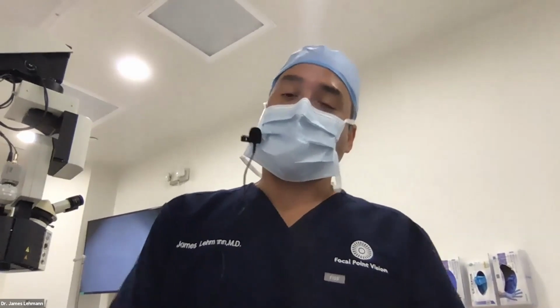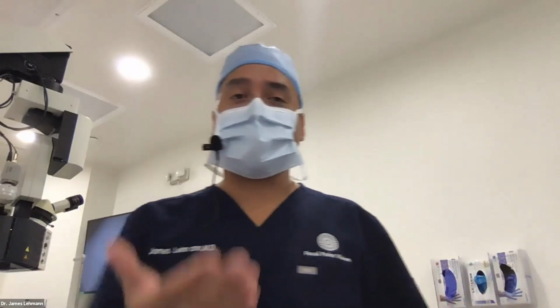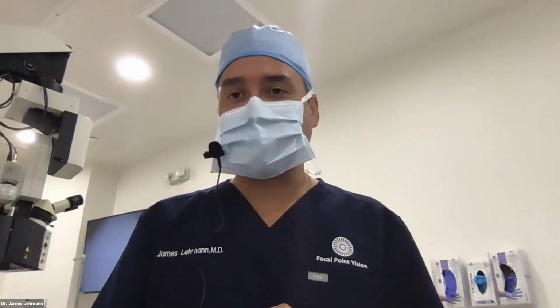Do you recommend lens epithelial cell cleaning routinely? That was Dr. Fard. I think you can spend an hour on a phaco going by and cleaning the posterior aspect of the anterior capsule the whole time. But I think as long as the center part is clean, you're good.